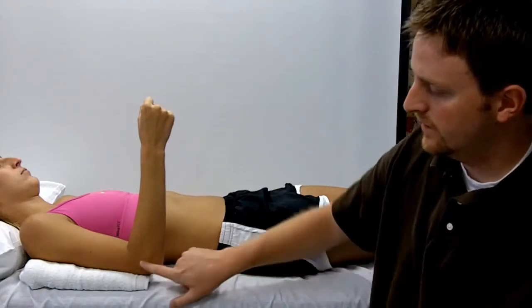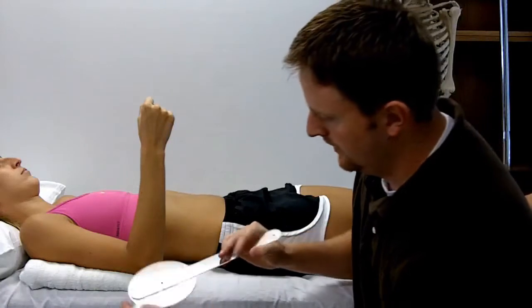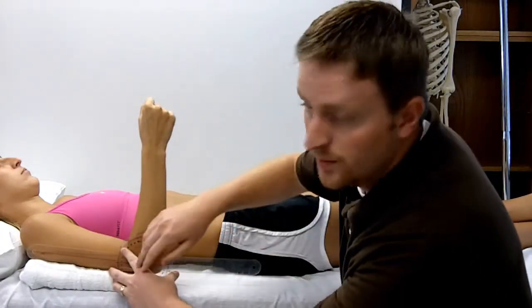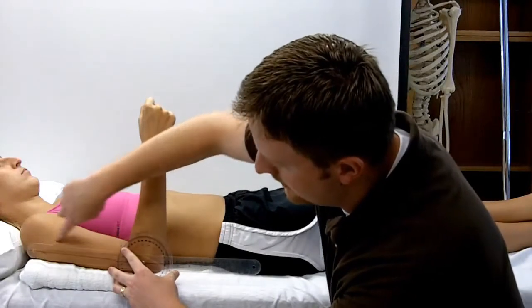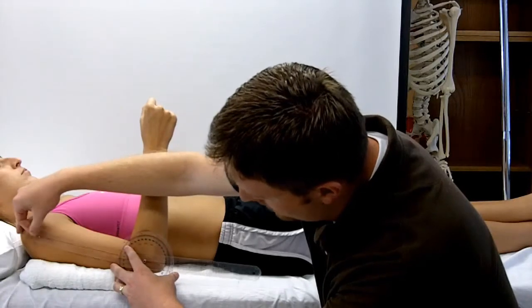The axis of rotation for the elbow is the lateral epicondyle, which can be palpated easily here. You can place your axis there like so. The stable arm in this case is going to be along the longitudinal axis of the humerus, or pointing to the tip of the acromion.